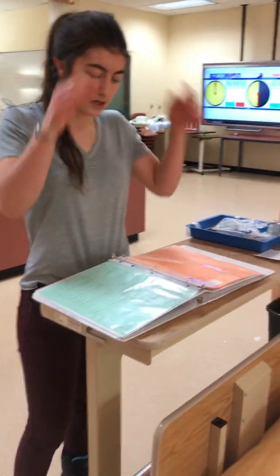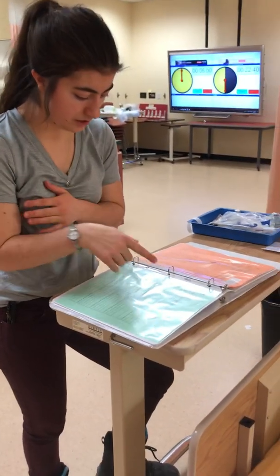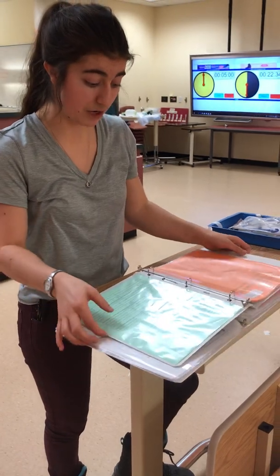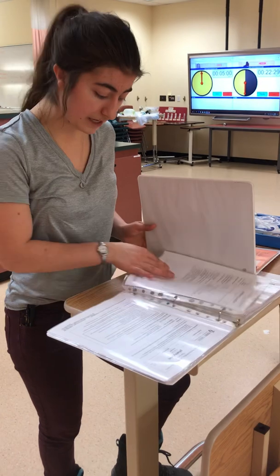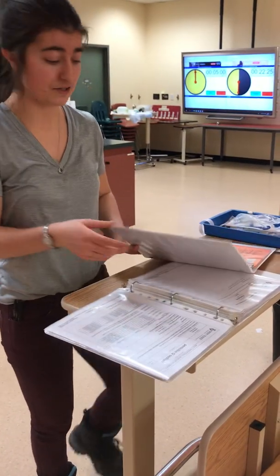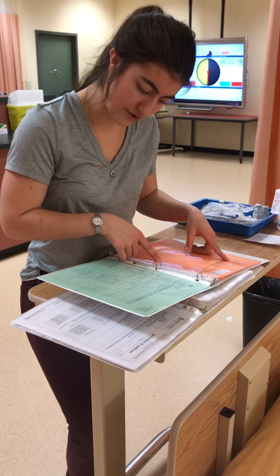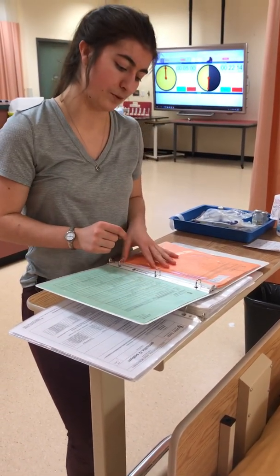J. Ames. So I'm going to be keeping in mind while I'm giving this medication that I have a normal saline IV line already running at 25 mL an hour, which I'm checking in the monograph of the medication I'll be giving, and it is compatible with normal saline, so this is okay. Now I'm going to be checking the order. I see also that there are no known allergies, and that is the same as the physician's order, so we're good on that as well.